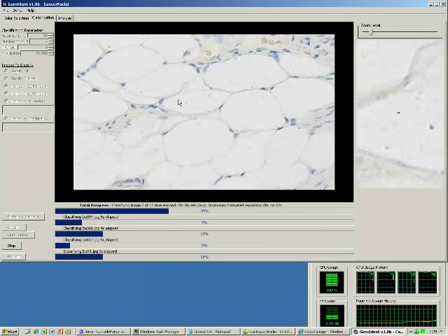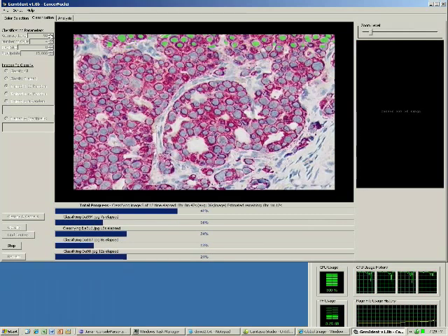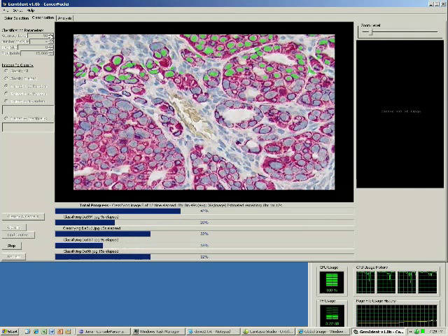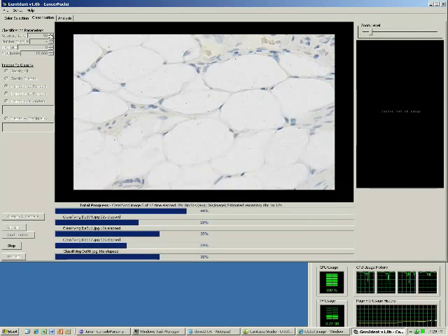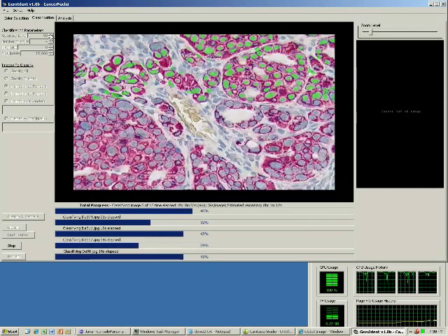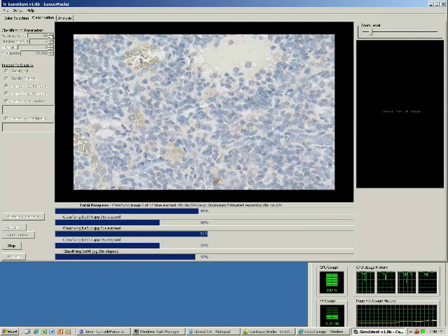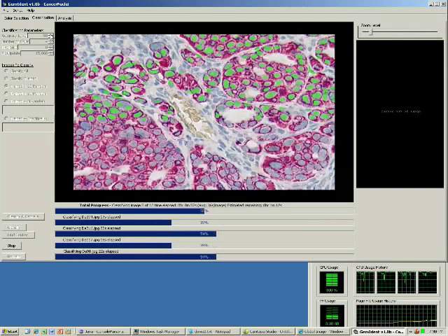Let's go over the classification parameters. The accuracy level refers to gemident internals about the machine learning classifier. For those interested, gemident employs random forests and the accuracy level is the number of decision trees grown inside the forest.